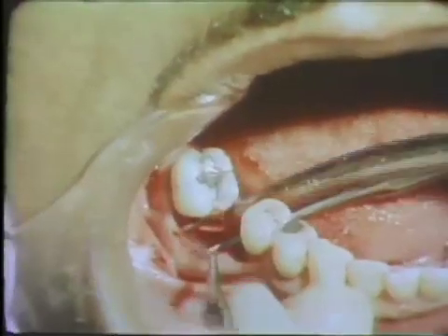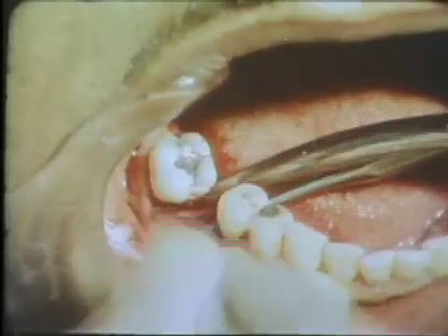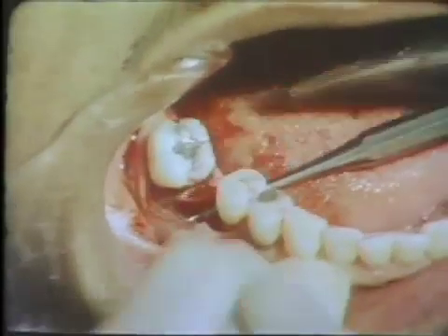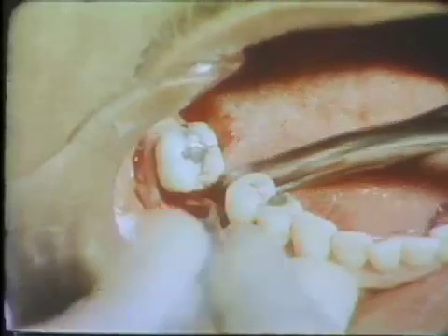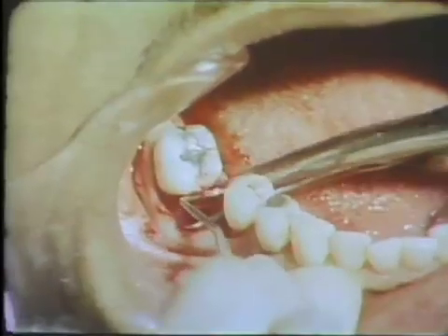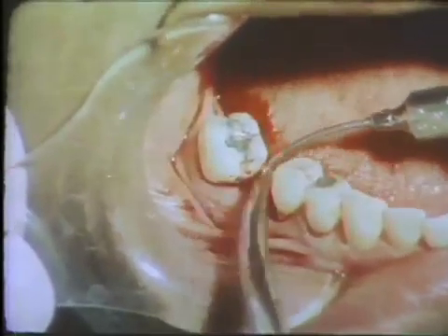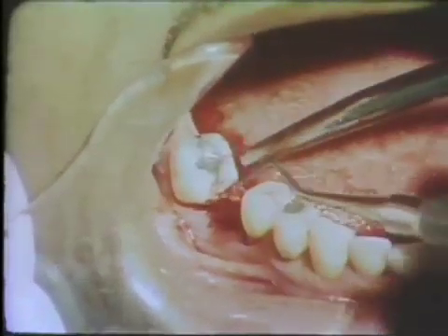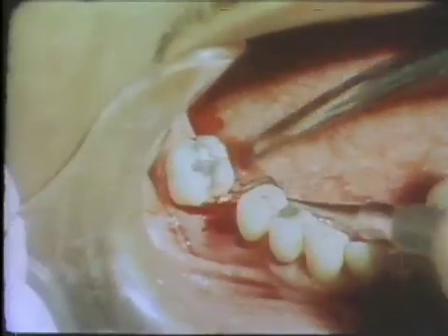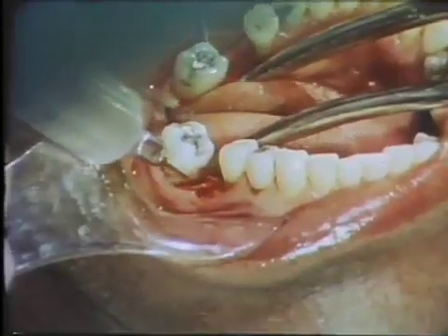The buccal flap is reflected, and the mesial surface of the tooth is planed from the buccal. Epithelium and chronically inflamed connective tissue is removed from the intrabony defect. The operative site is rinsed with sterile saline solution. Root planing and curettage of the walls of the intrabony defect is continued from the lingual side. The surgical site is again irrigated with sterile saline solution, and the topography of the defect is inspected.